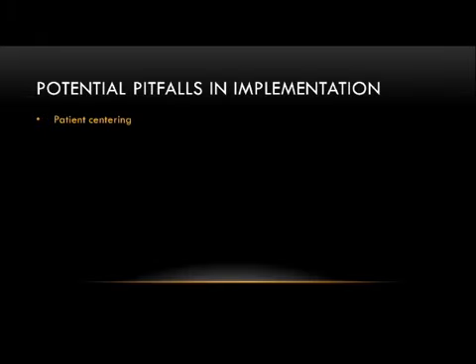So that's kind of an overview of the relevant different acquisition scan parameters that are used in AEC and tube current modulation. And so here we're going to spend some time talking about some of the pitfalls that you might encounter in either setting up your systems to use tube current modulation or in the use of them. And so the first pitfall, not surprisingly, if you've been paying attention, is our old friend patient centering. All kinds of exciting things can happen with patient centering.